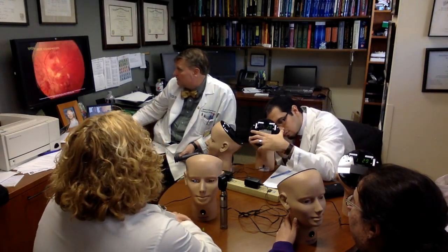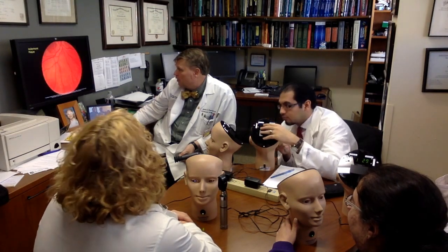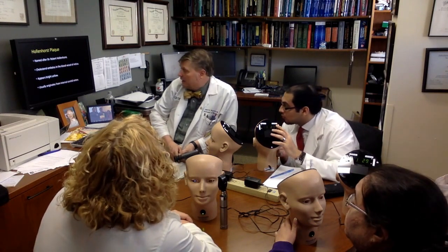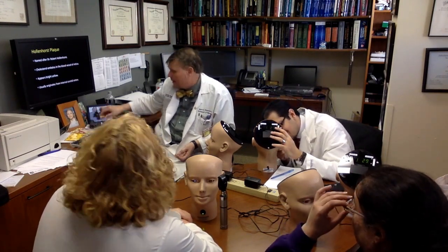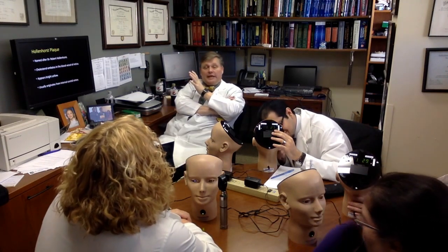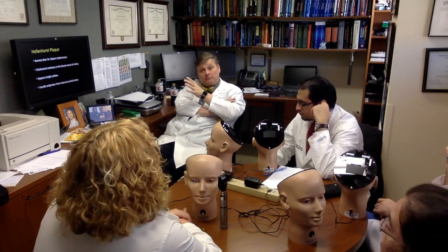Now, one I don't have a picture of, which I do want to go over, is the Hollenhorst plaque. The Hollenhorst plaque is often seen when you have carotid disease, although to be fair, it could be aortic disease, and you break off a plaque, not a clot, but a plaque.